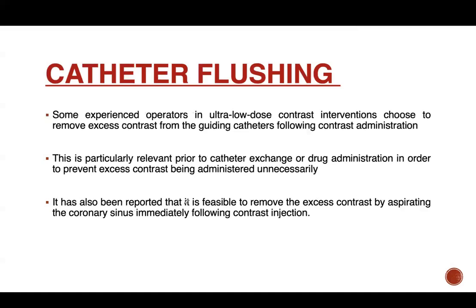Next, catheter flushing. This is also an important technique. Some experienced operators in ultra low dose contrast intervention choose to remove excess contrast. Whenever contrast is not required, some amount of contrast is always present in the guide. If you want to administer any drug or do a catheter exchange, always remove that contrast from the guide. You can aspirate the guide so that the extra contrast is not injected into the coronaries or into the circulation.